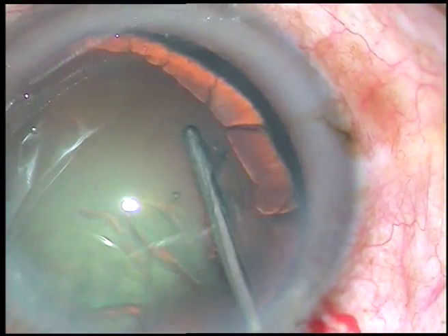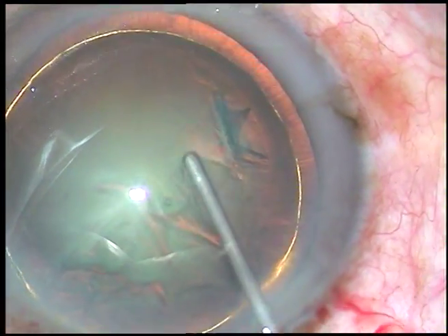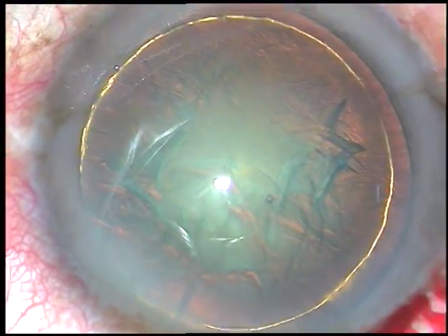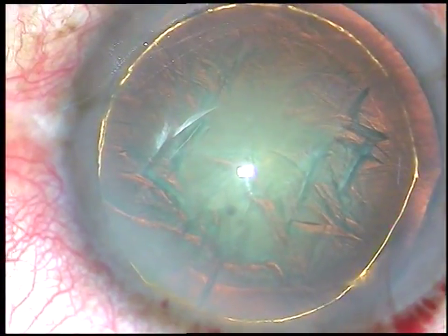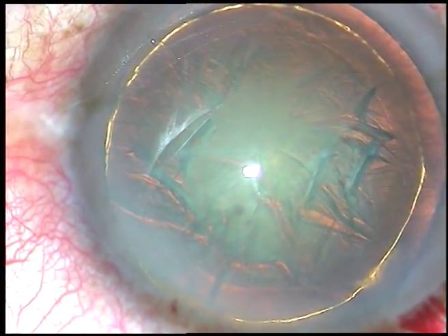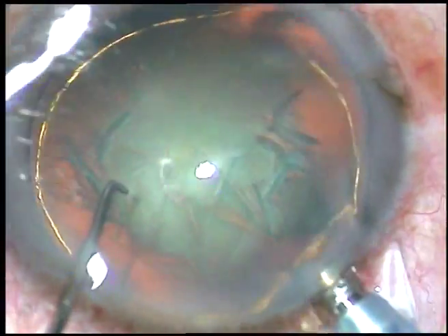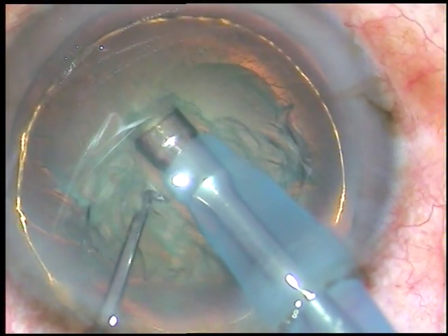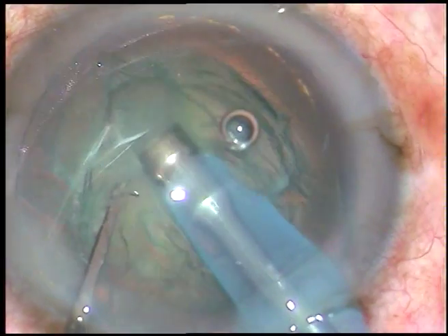Hydrodissection is done, now hydrodelineation. See, hydrodelineation has produced a beautiful golden ring in this case. In my early stages of learning, this golden ring inspired me a lot to go for phacoemulsification. I remember on a live surgery session by our guru Dr. Suhas Haldipurkar, who got exactly a similar golden ring, and it excited me tremendously.